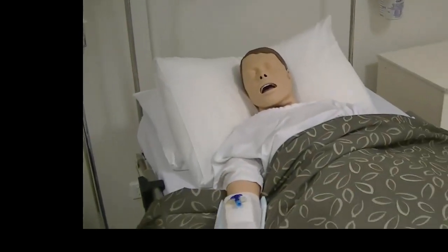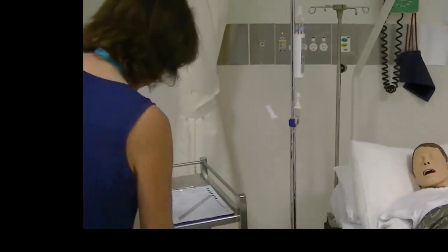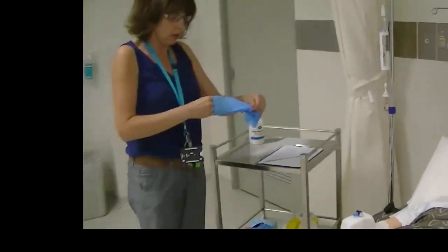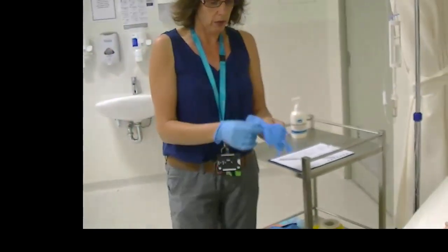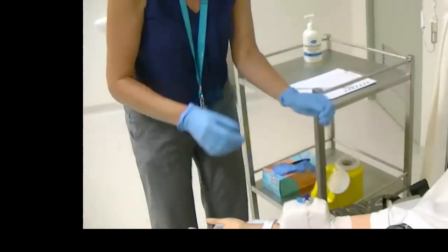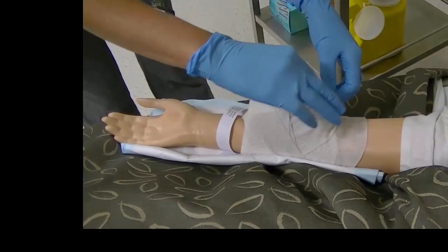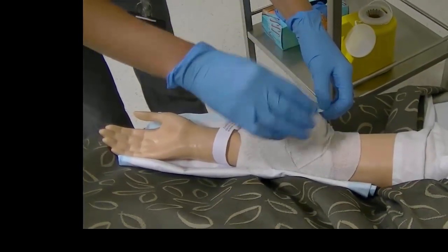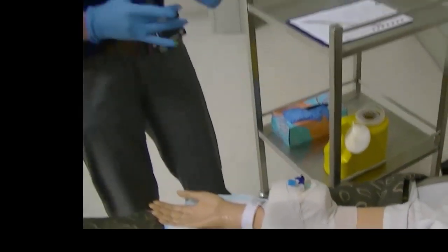Before I start though, I just need to check your IV cannula and the IV site to make sure it looks okay. So I'm just going to put gloves on because that will protect me from any contaminants such as body fluids. Okay. Here we go. How does that feel, Jessica? Have you got any pain? It's not sore at all. It looks good. There's no bleeding, no exudate, no fluid, and it doesn't look red or hot or feel hot. Okay, so I'll go ahead with that.